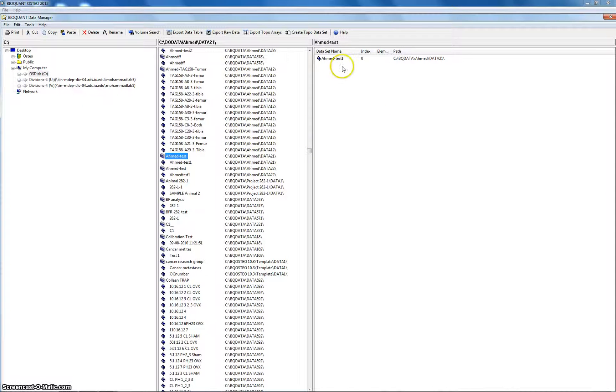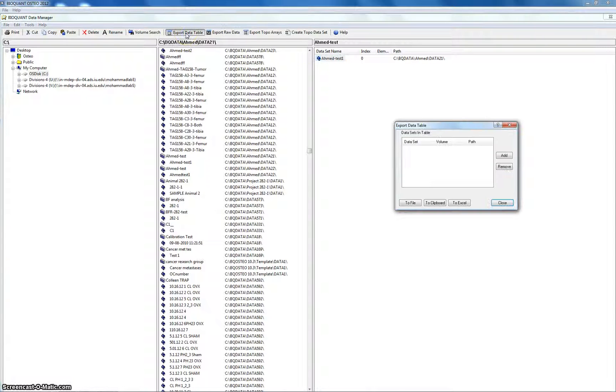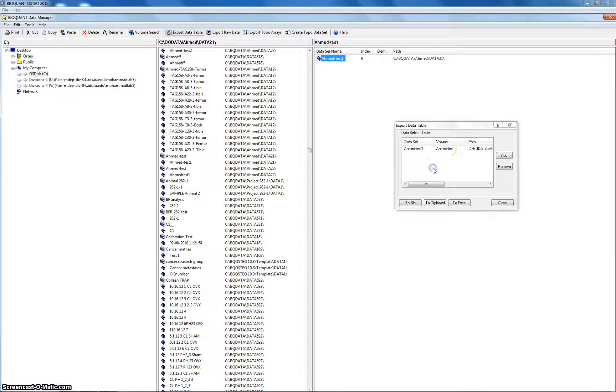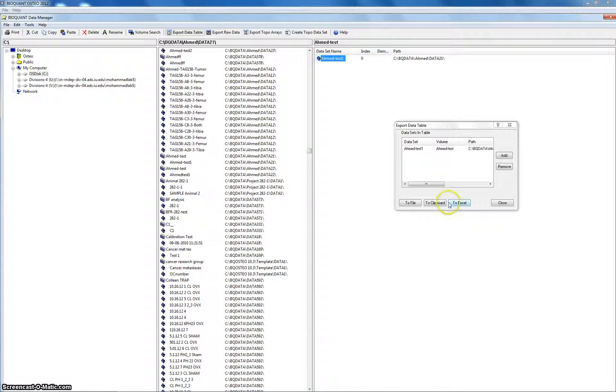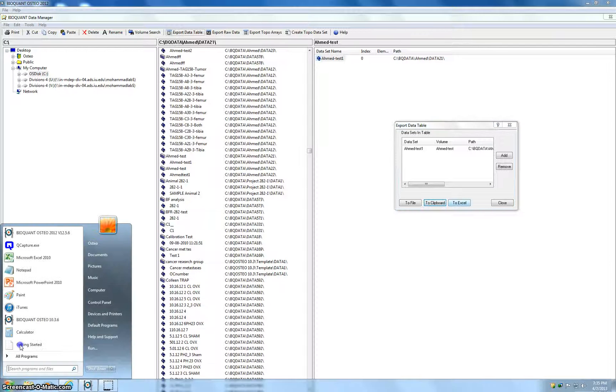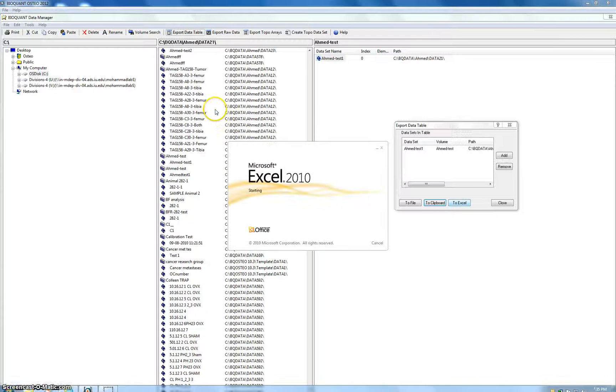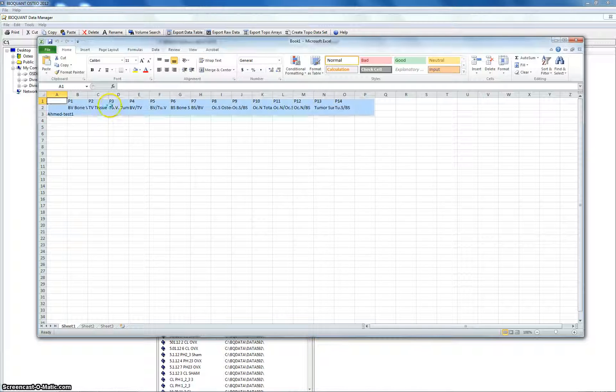Once you're here, you could export the data table. That's what I do. So you can just drag it in here. This is our sample. And you could export it to Excel sheet. Sometimes it works. Sometimes it doesn't. So safely, you could just do it to a clipboard. And then you go open an Excel sheet by yourself and you paste it.